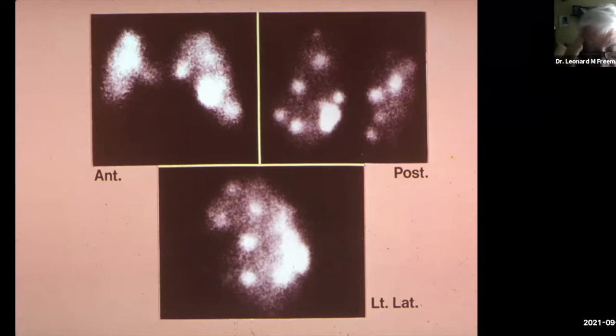So when you finally do get to inject it, you can see these hot spots throughout the lung are actually just larger particles that have been congealed in the syringe because of the difficulty with the injection, and they're being blocked in much larger portions of the arterial tree. But still, with the factor I gave you, with the billions of capillary beds we have in our lung, it's still not a problem. Just messes up your interpretation. That's about it.